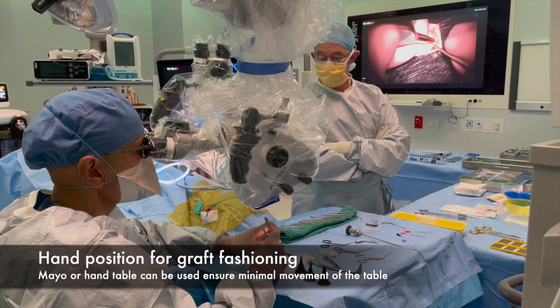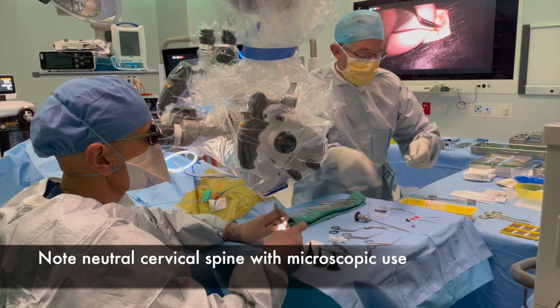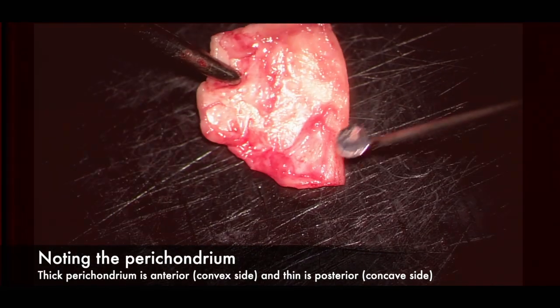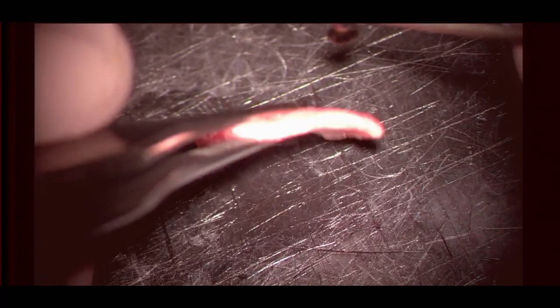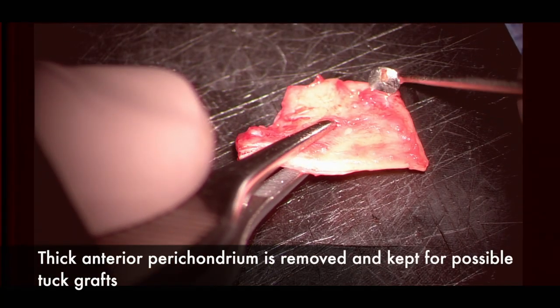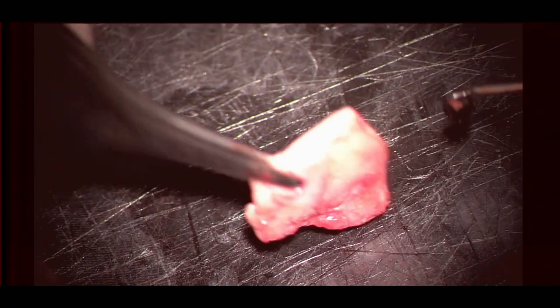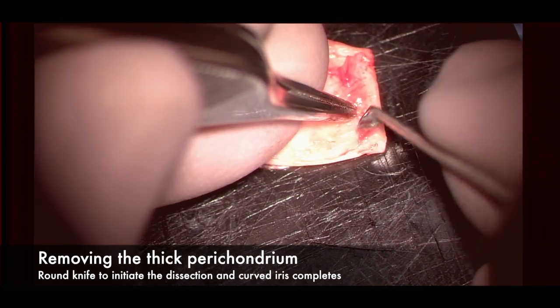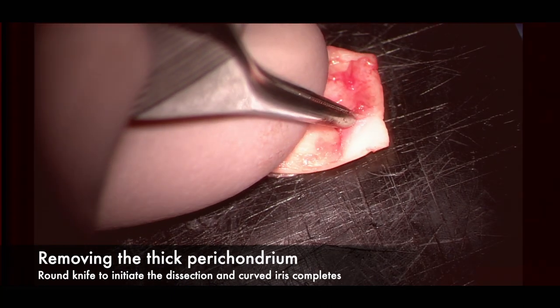Returning to the hand position for fashioning the graft on a mayo or hand table with a neutral cervical spine. The cartilage dissection is performed on a cutting block. Note the thick perichondrium on the convex anterior side and the thin perichondrium on the posterior concave side, which will become the lateral aspect of the graft. The thick anterior perichondrium can be used for tuck grafts. Beginning the dissection by removing the thick perichondrium — starting with a sharp round knife then moving to curved iris scissors.